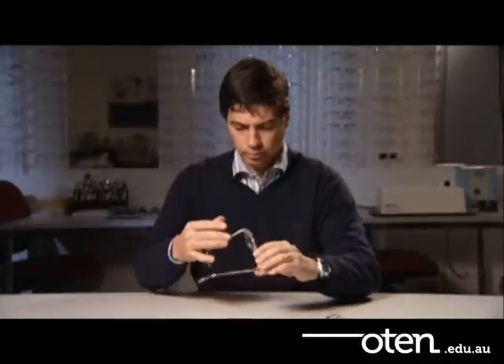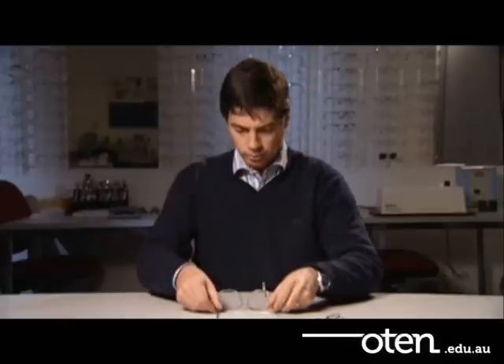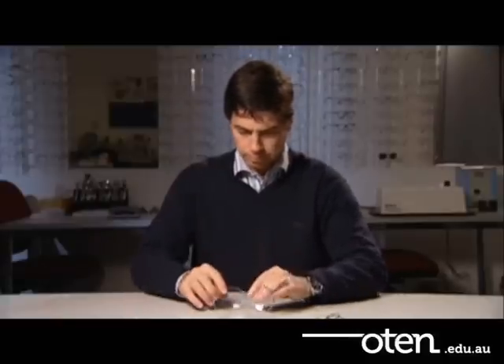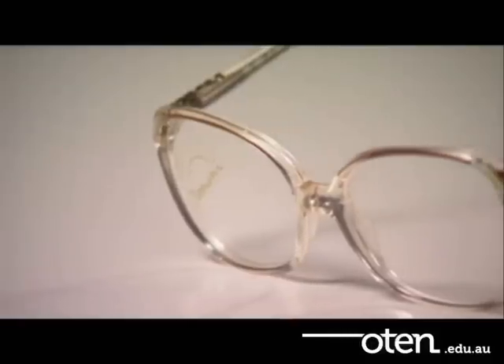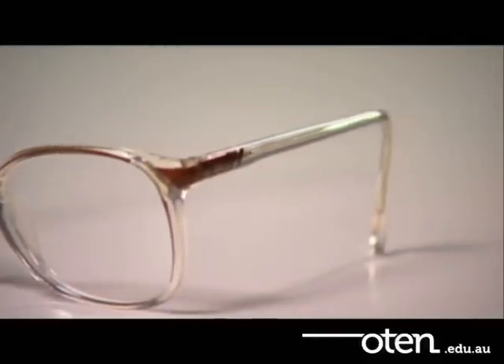To place any frame into standard alignment you need to complete 9 steps in the following order. The order is very important as you must start at the frame front and work your way back to the temple ends.